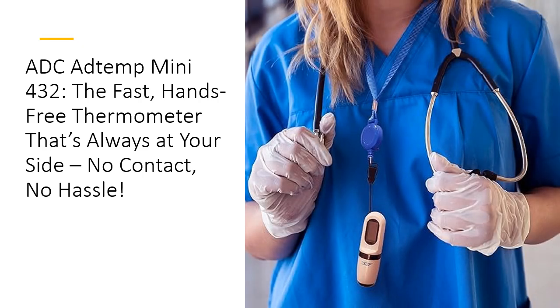Ideal for healthcare pros and parents alike, the AddTemp Mini 432 combines ADC's commitment to quality with ergonomic design. Founded on inclusivity and care, ADC has been crafting superior diagnostic tools for over 40 years. Experience the reliability trusted by clinics, hospitals, and homes alike. Get your ADC AddTemp Mini 432 today and turn every temperature check into a quick, seamless process.